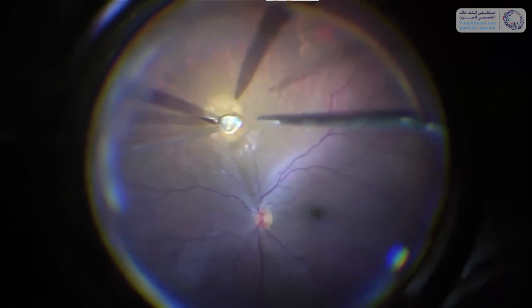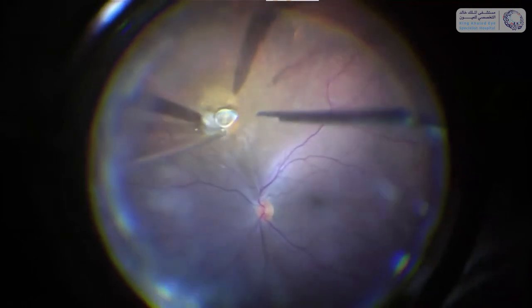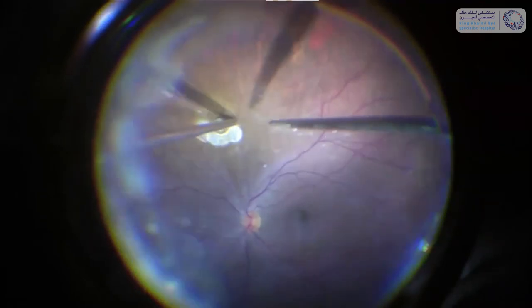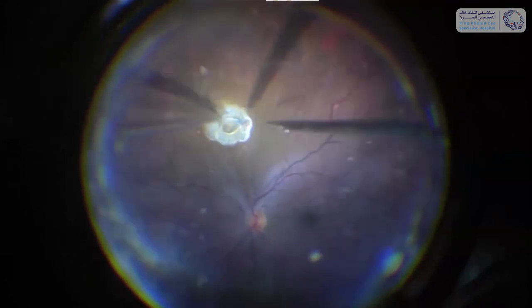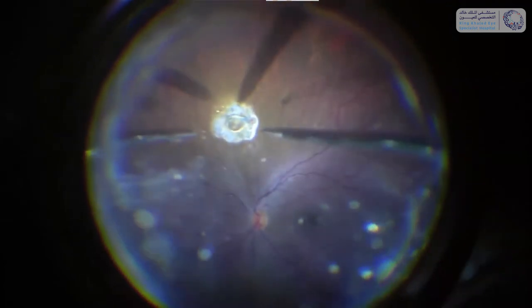So what I decided was to use an endocautery and actually remove in that way the retina around the foreign body. I used a very harsh coagulation which actually removes the retina around the foreign body. I scanned again and could see that there was no connection anymore between the foreign body and the surrounding retina, and then I needed to grasp it.